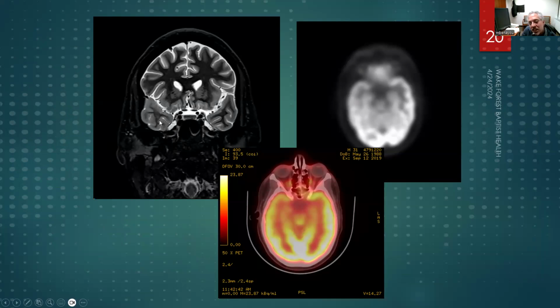So this was a sign anatomically that there's been some axonal injury in the right temporal lobe, which is not completely localizing of the seizure onset zone that you would resect, but goes along with the idea that there's been some damage to the right temporal lobe, and we're probably in the right neighborhood of the seizure onset or area we should be focused on from a seizure perspective.